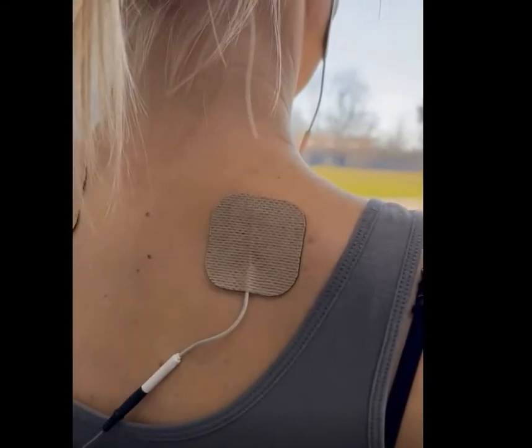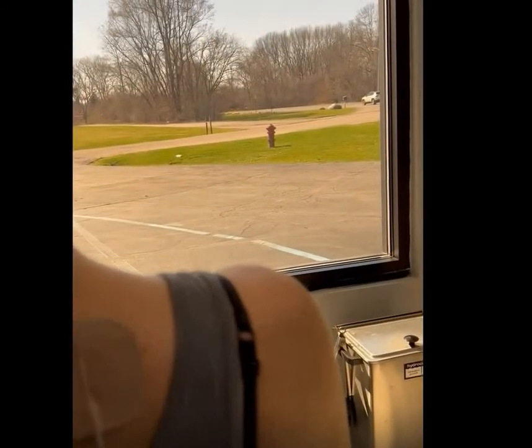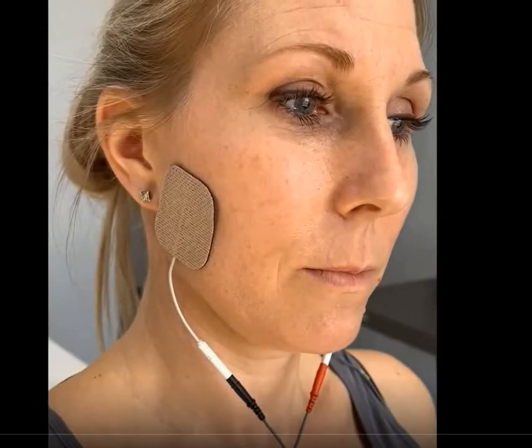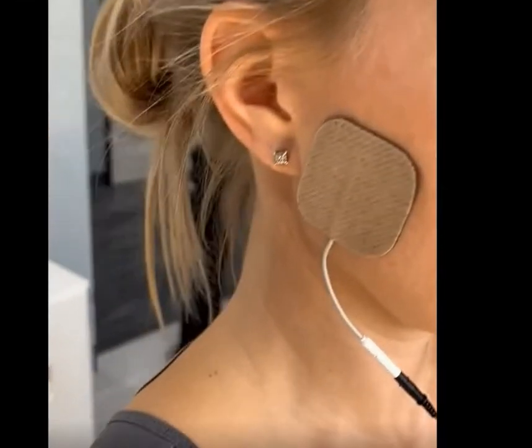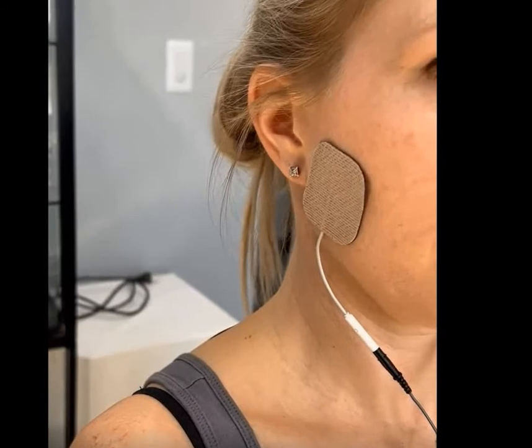Once you feel comfortable with the trapezius stimulation, then you start the same routine for the masseter. What you are looking for in this case is your lower jaw to move up and down as though you are slowly clenching. If you feel any pain at all, stop the unit or simply unplug the leads. After about five minutes, this is the movement that you should be seeing and feeling. The key is to have your jaw, lips, and everything contracting. If this is not happening, then you are not getting the benefit from the unit. You must continue to turn up the voltage until you get to this point.